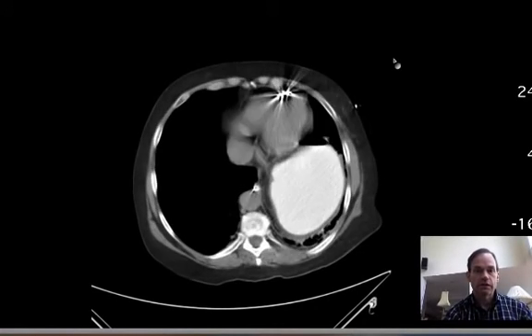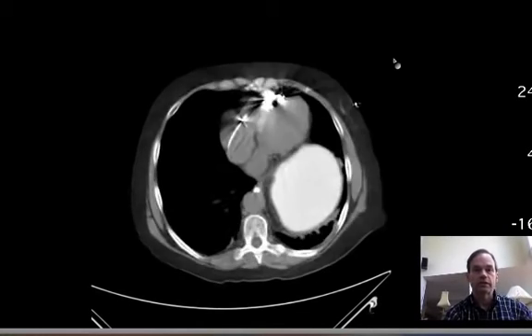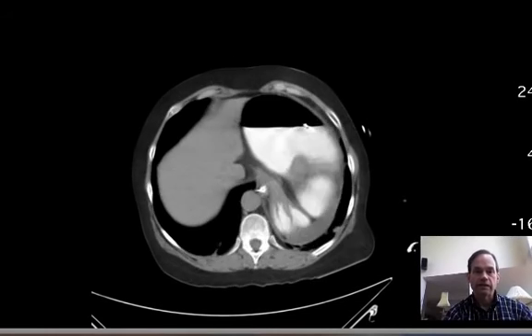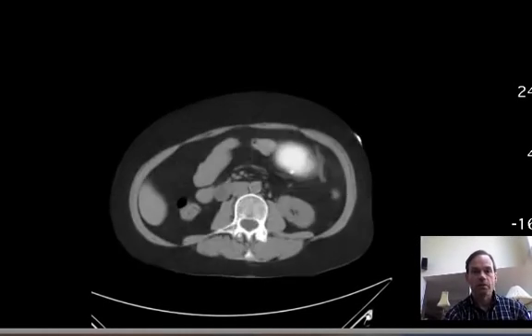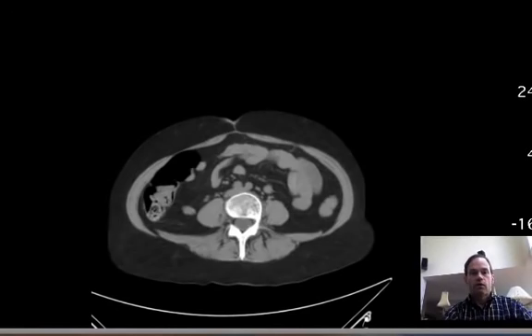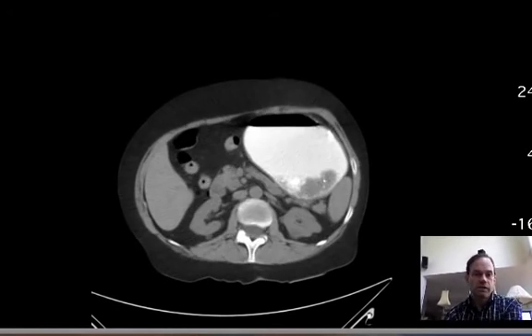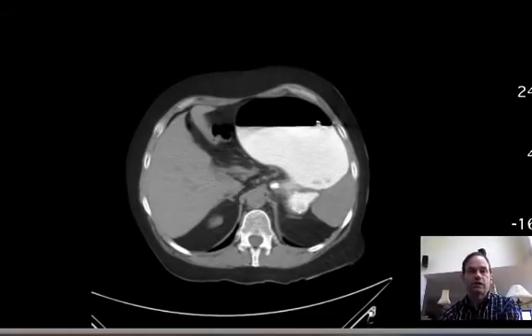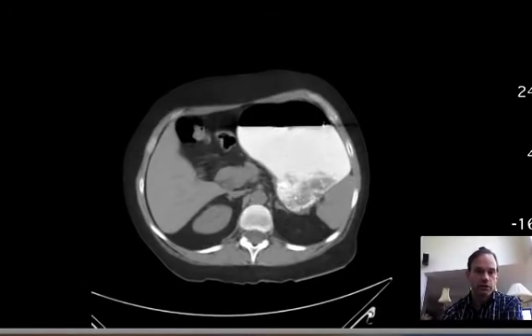This is actually the uppermost images. They had to be done in two parts — I think we missed the highest level on the initial series. Now here we're going down lower. The stomach here is dilated. All the oral contrast is still in the stomach; I don't see any coming out into the duodenum.